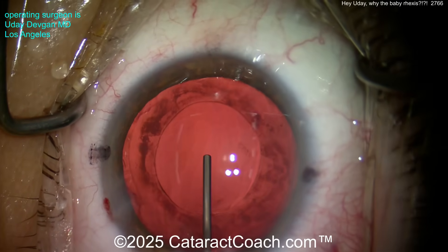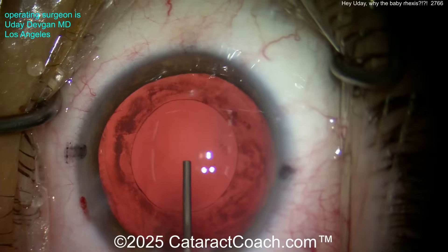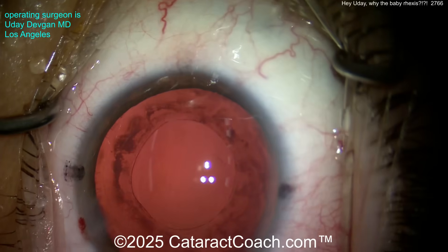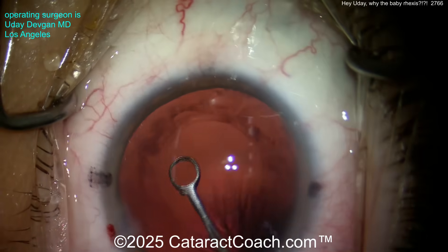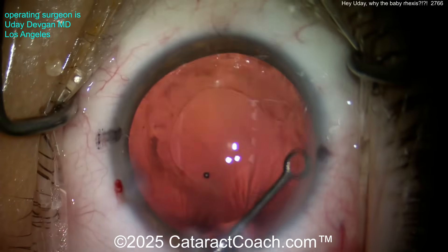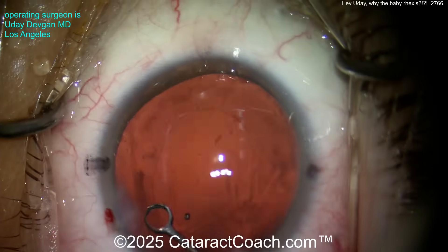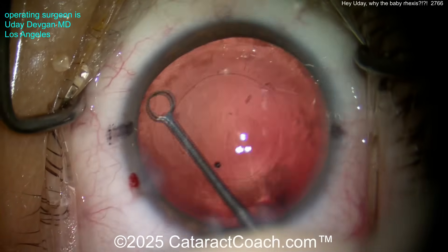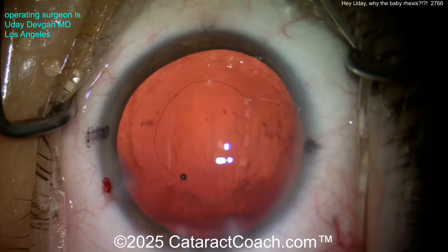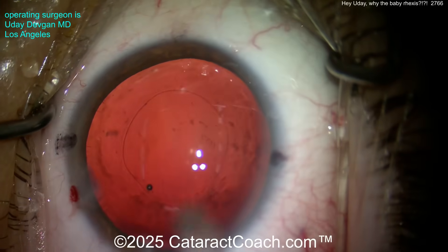Here comes the cohesive viscoelastic filling up the capsular bag. I think we need to do a little capsule polishing — look at that hazy material on the underside of the anterior capsule rim. Going in here with the polisher, cleaning all that off. Does it make a difference? I don't know, but it makes me happy. Studies have shown contradictory results, but you've got to do your best surgical judgment.